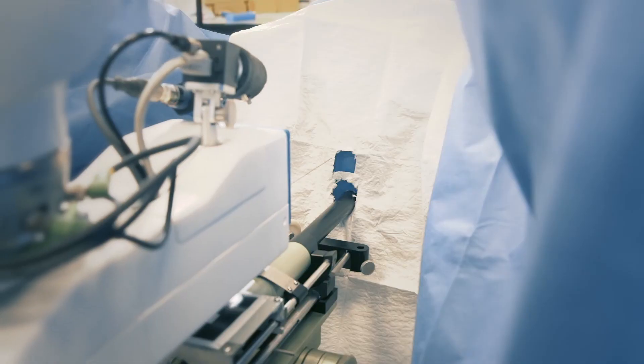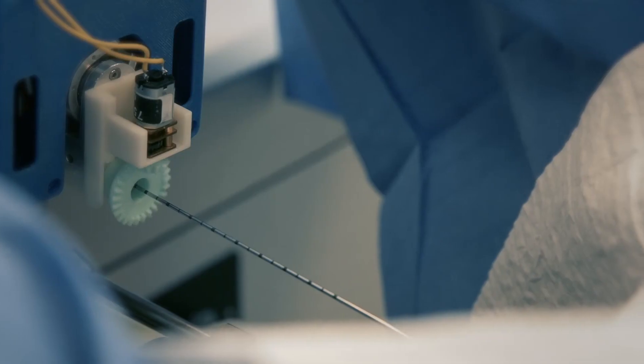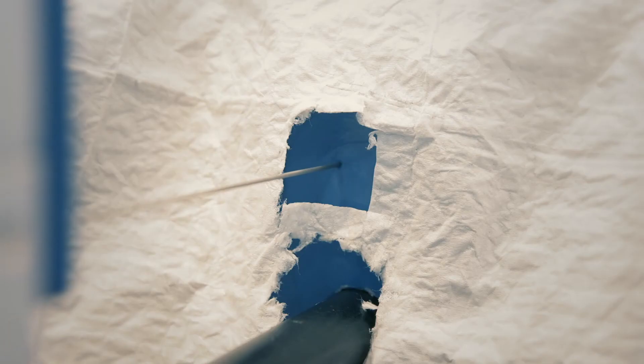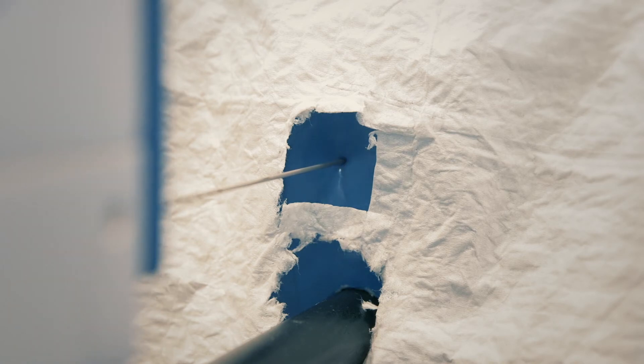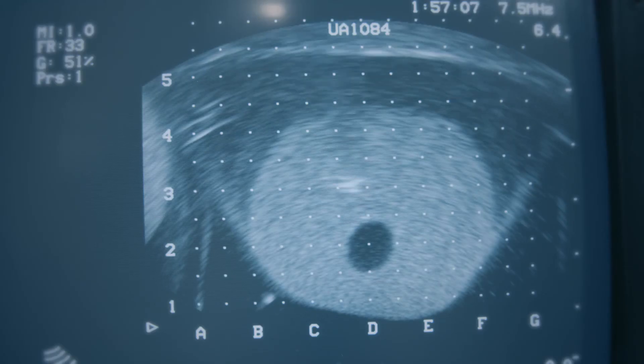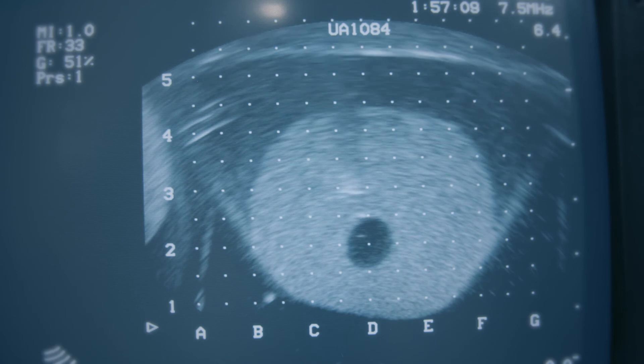A servo motor is placed at the top side of the needle to rotate it during insertion through the skin in order to reduce the effect of static friction during insertion.